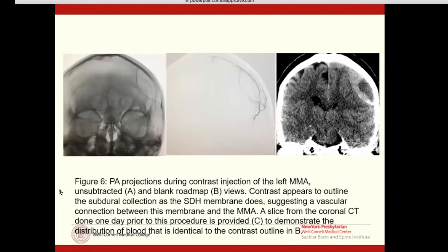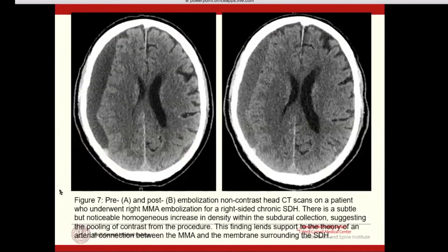This picture I like very much. On the right we see a coronal view of an acute-on-chronic subdural hematoma, and on the left you see an unsubtracted and in the middle a subtracted view. The contrast takes the exact same shape of the subdural membrane itself — again radiographic evidence of an arterial input to the entire shape of the subdural hematoma.